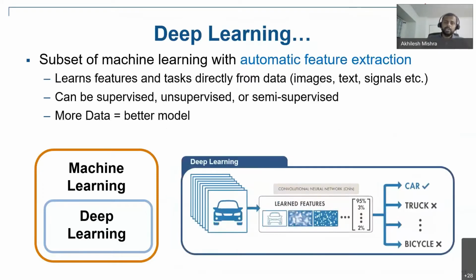But with deep learning, the pro is that you can directly train your models on the input data like raw images. But the con with this approach is that deep learning is often criticized by certification authorities as a black box network.